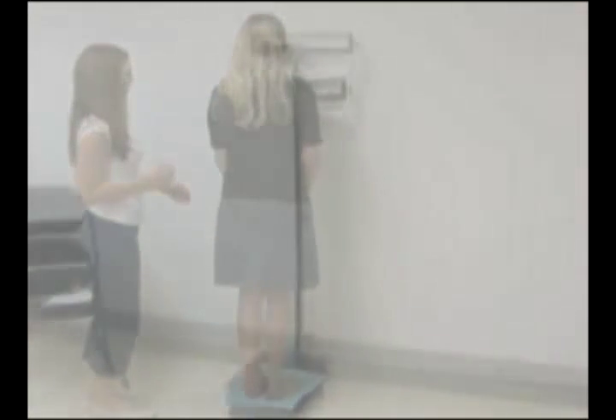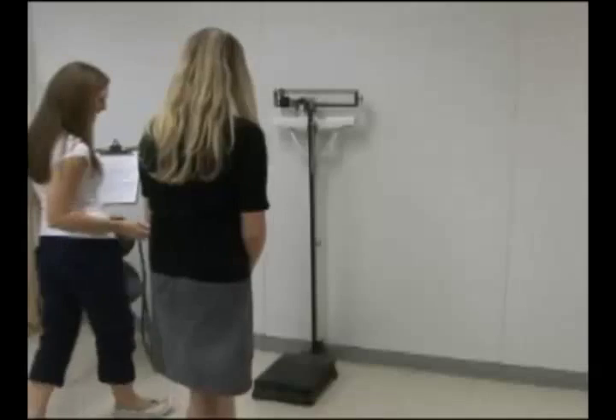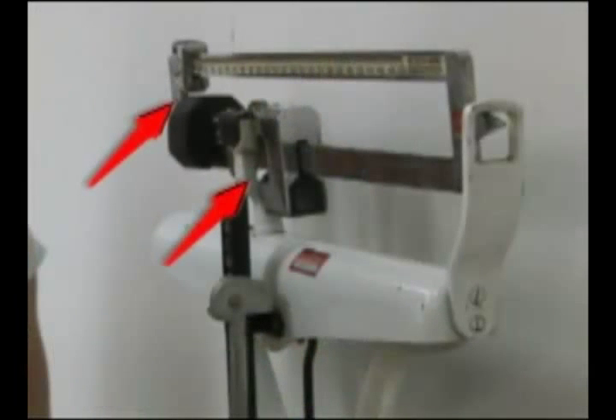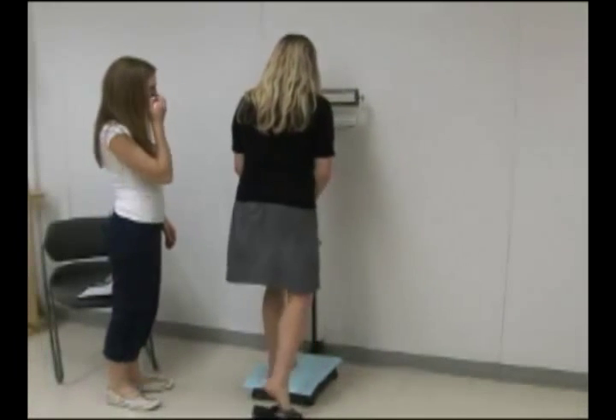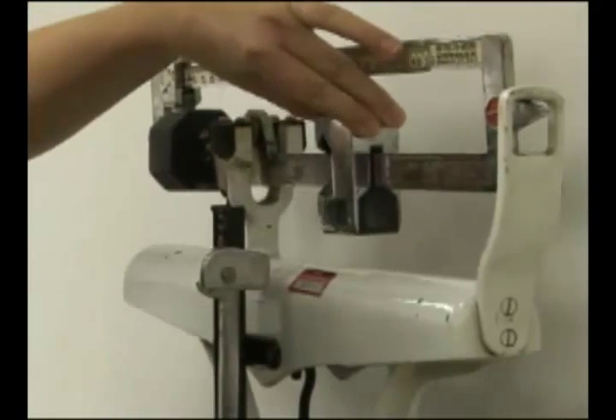Here, we'll be using a balance beam scale to measure the weight of an adult. Before weighing, have the adult take off her shoes and any heavy clothing like jackets or sweaters. Make sure the upper and lower counterbalance weights are at the far left at zero. Have your client step onto the scale and remain still, and move the lower weight over to the right until the indicator arm drops.